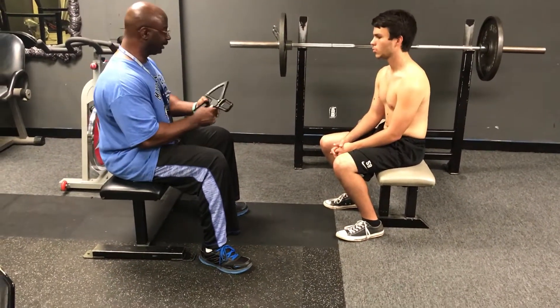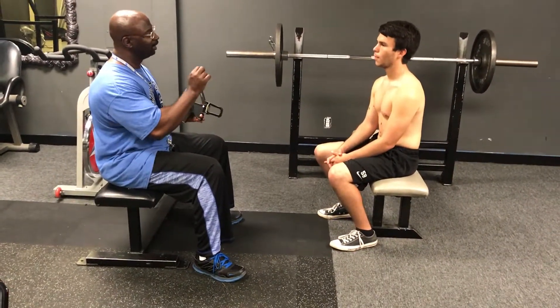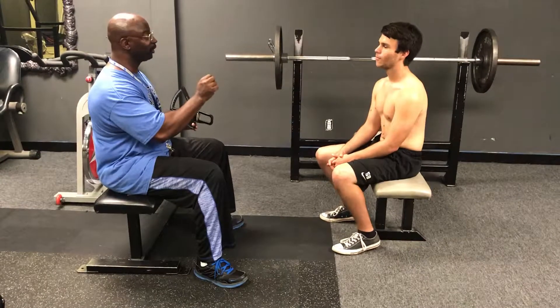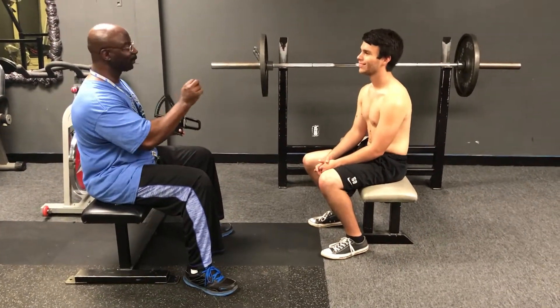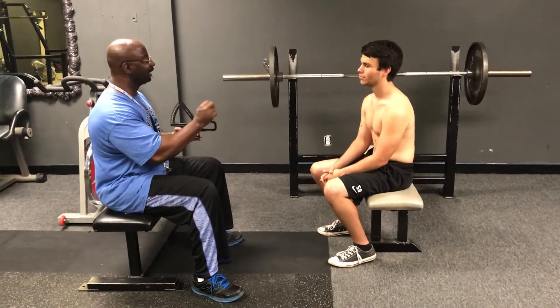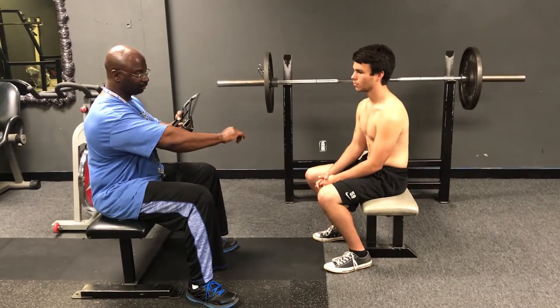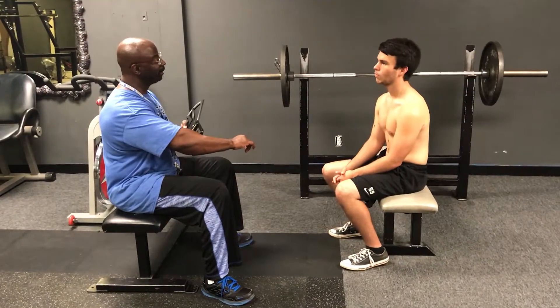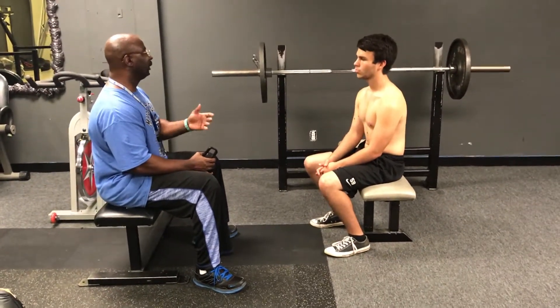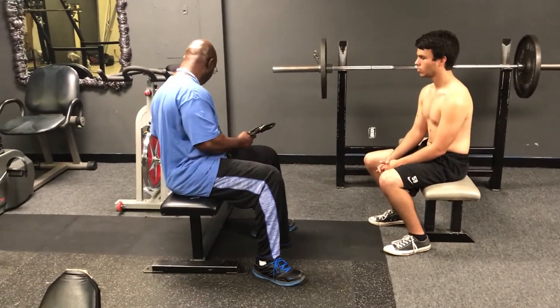I'm going to measure your body fat with the skinfold device. I'm going to pinch your skin — have you had a grandma pinch? Those are the worst pinches in the world, but it's nothing like that. It's just a nice little pinch. I'm going to take the caliper, clamp it on top of that skinfold, and it gives me a measurement. After nine measurements on different areas of your body, I put it into an equation and it tells you your body fat percentage.